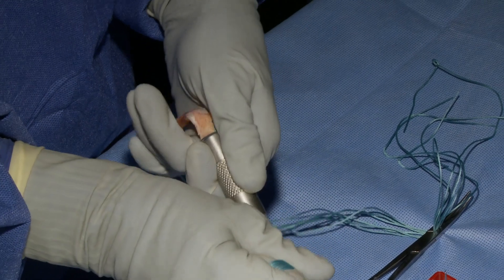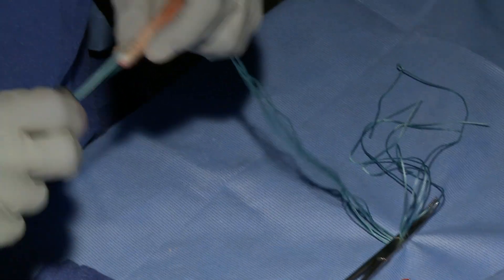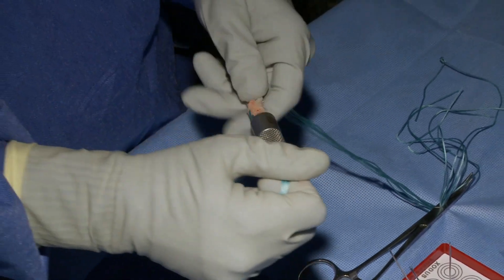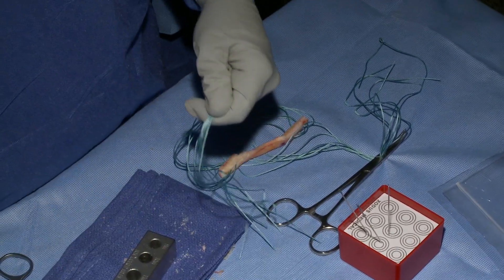You want to try to pass the graft through a 10mm cylinder and see that it passes smoothly, and you want the graft to fit perfectly into the femoral tunnel almost like a press fit.